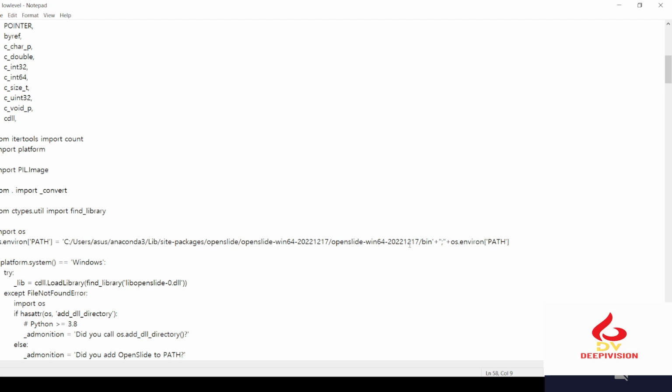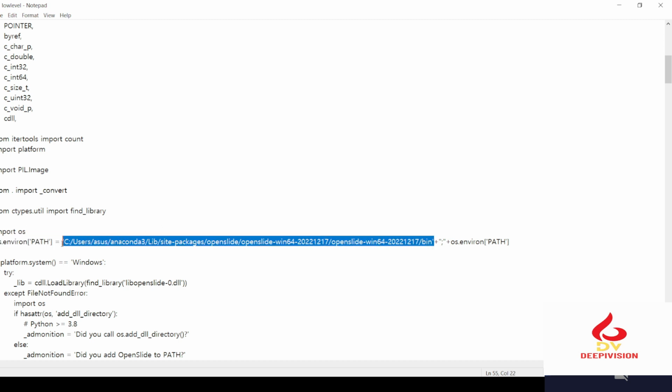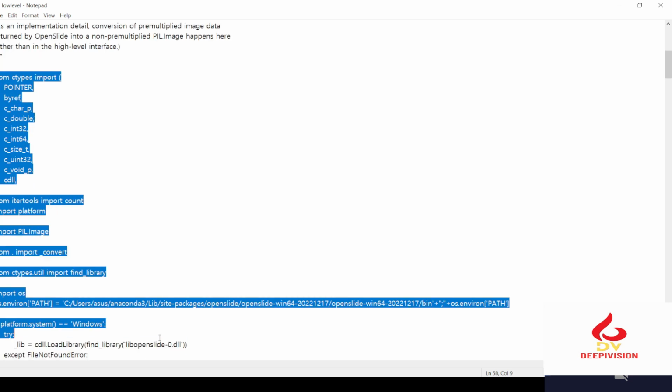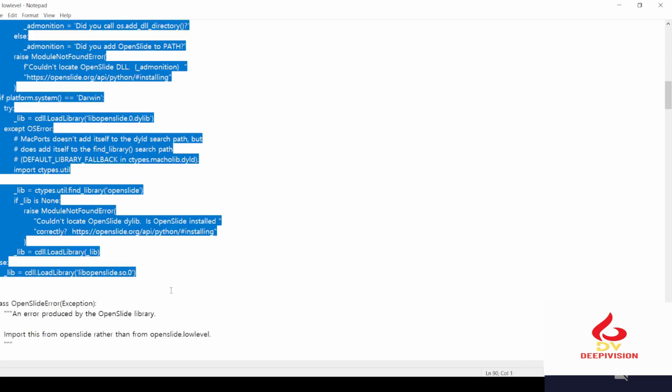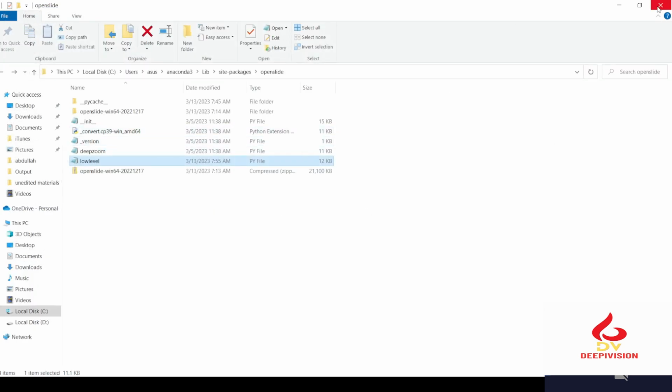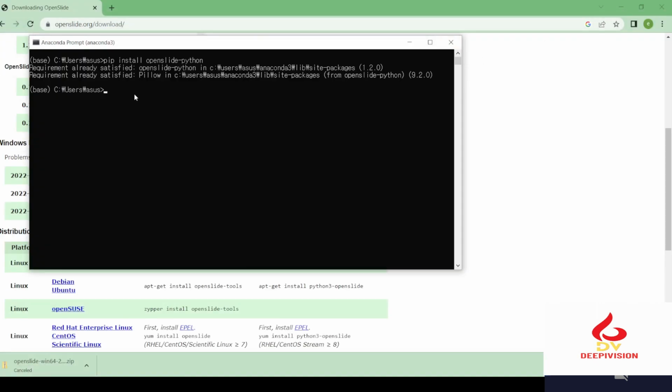A second thing is that the bin folder you can put here till bin. In my case, it is different. It will be different because the path is different from yours, so you need to change this path and copy paste from here to here again. Okay, so here, just change the path, then save it, Control S, then just close it. Okay, all things you need to close. If you want to remove this, you can just delete it. Okay, close. Everything is closed.